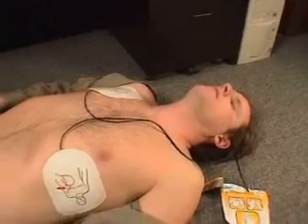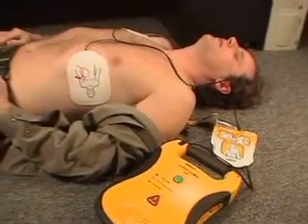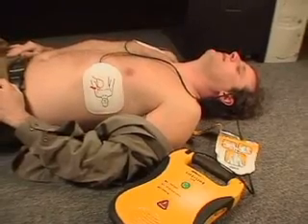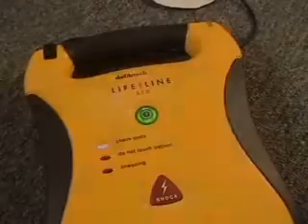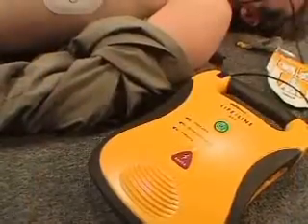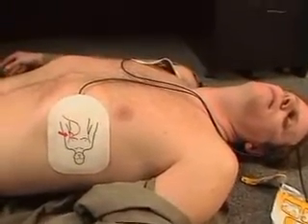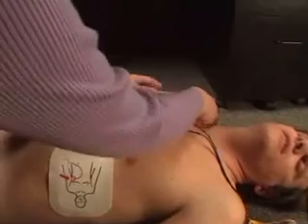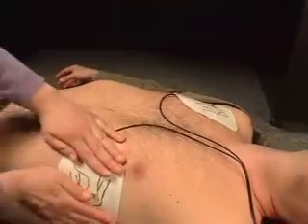No shock advised. The Lifeline AED will not shock a victim that does not require a shock. Poor pad contact to patient. Press pads firmly. The unit automatically checks the connection of the pads to the victim and lets you know if the connection is bad. Make sure the pads are properly attached to the victim and not touching each other. If needed, reposition the pads and dry or shave the victim's chest.